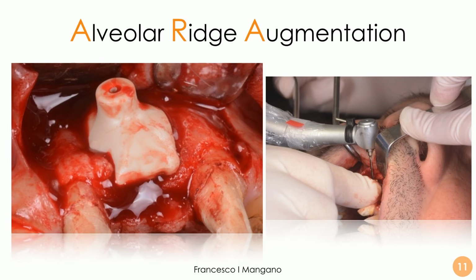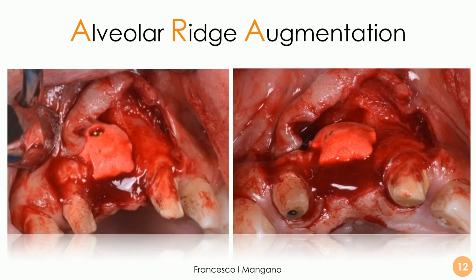the bed for the fixation screw that we will use with the actual hydroxyapatite beta-tricalcium phosphate synthetic CAD/CAM scaffold that is here placed in position, screwed in, and completely perfused by blood. Angiogenesis is the fundamental key prerequisite for osteogenesis. So without angiogenesis, we cannot pretend to have osteogenesis. So the scaffold must be entirely perfused by blood, and if possible, we can make some cortical holes to enhance bleeding in order to have better results.